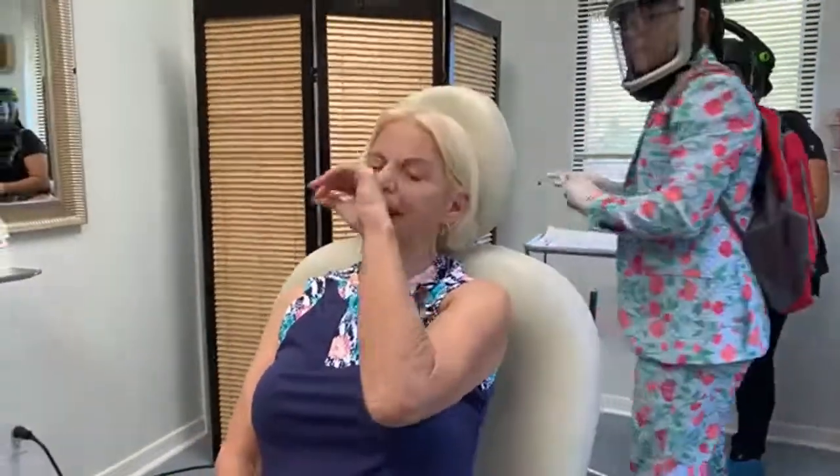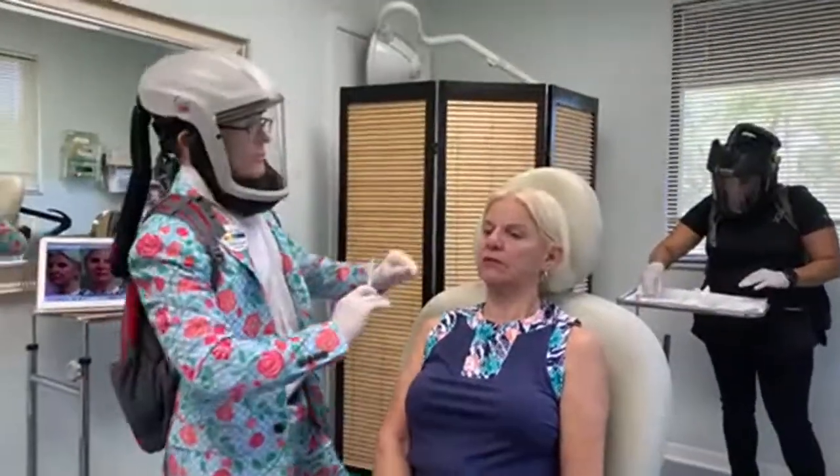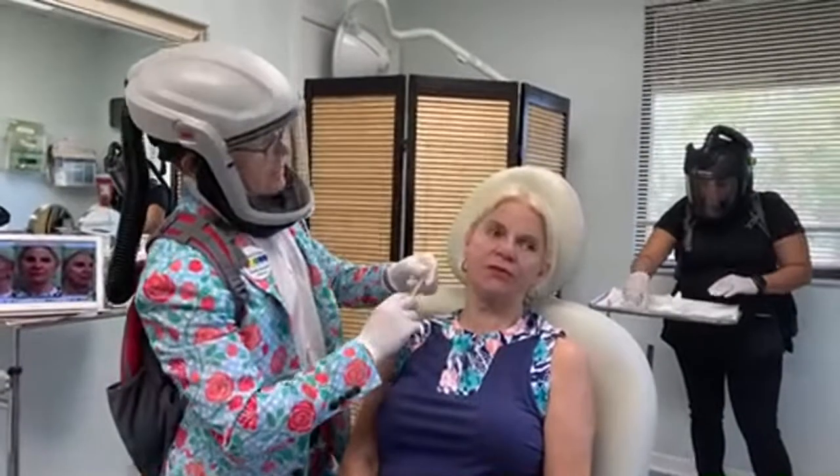What about bruising after the procedure? Usually after fillers, you'll have little or no bruising. But if you bruise, it can last for 4 to 7 days, and you can cover it with makeup. So bruising happens. Try and stay off the blood thinners, off Motrin, ibuprofen. Let me turn your head this way. I'm not a big bruiser.